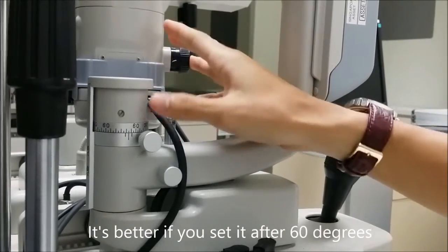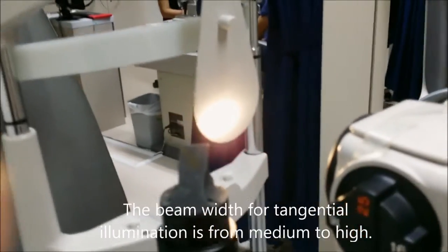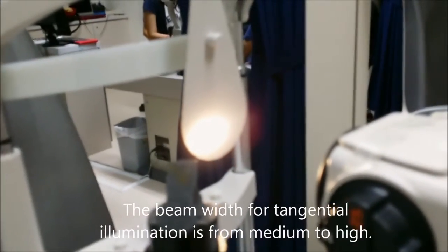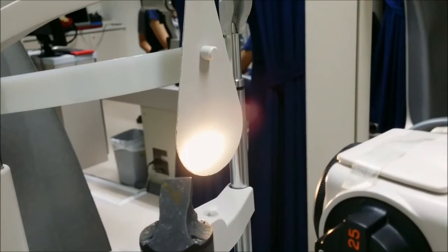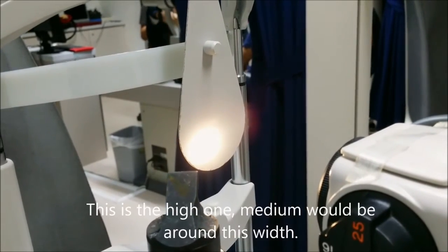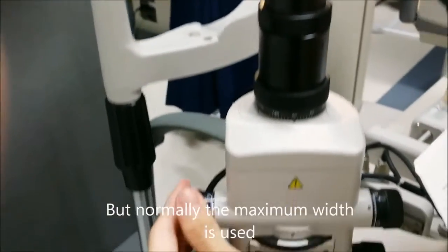It's better if you set it after 60 degrees. The beam width for tangential illumination is from medium to high. This is the high one. Medium will be around this width, but normally the maximum width is used.